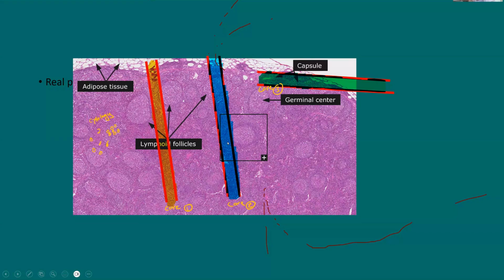Only 2 or more core biopsies are ideal for a full assessment. Example number 3 is an inadequate core biopsy that goes through the capsule. So we aim to have one or two cores like core number 2, so we will gain a good assessment. This is the general map.